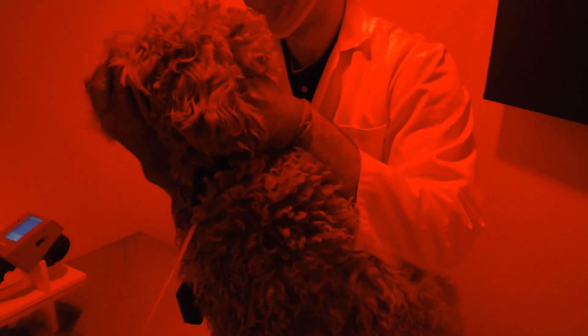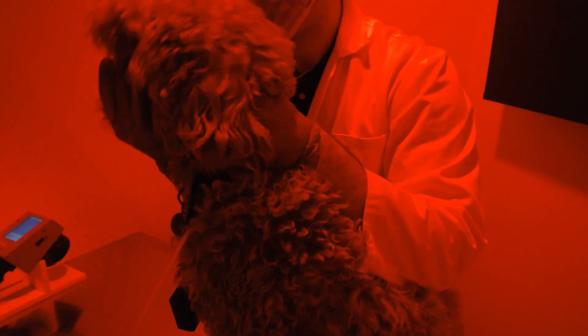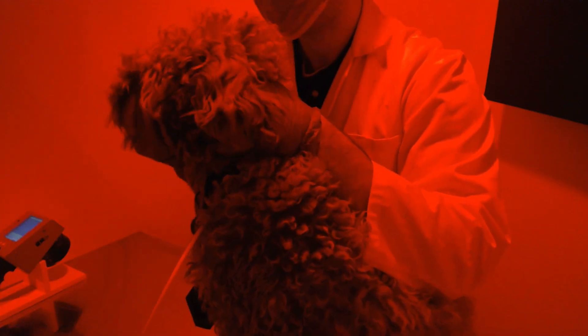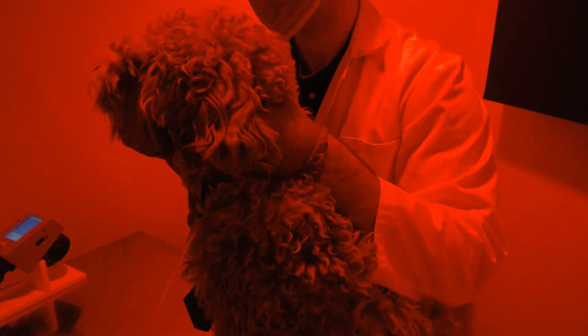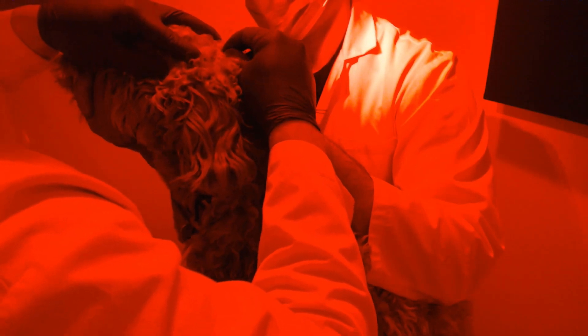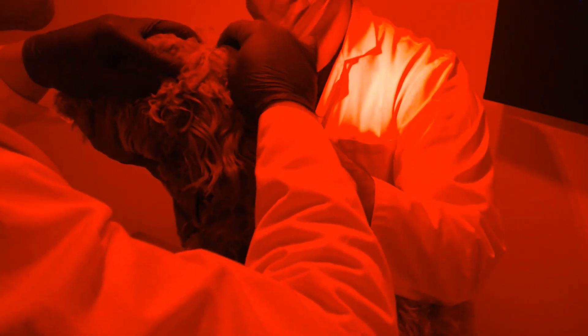We will now start placing electrodes. The first one is the green subdermal ground electrode. A second person is always helpful to hold the dog while you are placing the electrodes. You can see my partner here showing the best way to hold the dog — one hand under the chin and one on the back or stomach. The ground electrode is placed on the occiput on the back of the head, and a piece of tape is applied to hold it in place. The other side of the electrode can then be plugged into the pod box in the ground position.